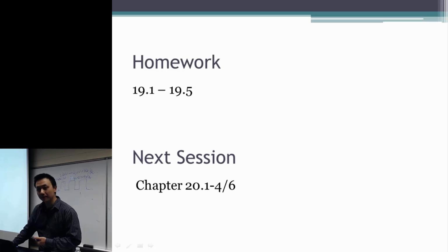I have a little bit of a practical question. We ran a diffusion experiment at 7T. The SNR was not in the order that we would like it to be, so we increased the voxel size at the first step and then increased the number of acquisitions, but it is not satisfactory in terms of SNR. Is there any other way that we can increase the SNR?